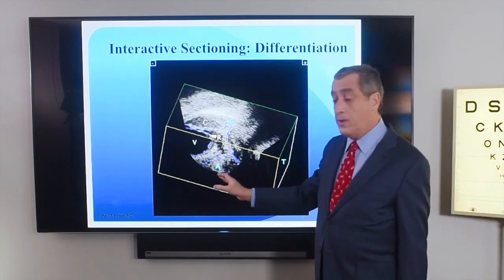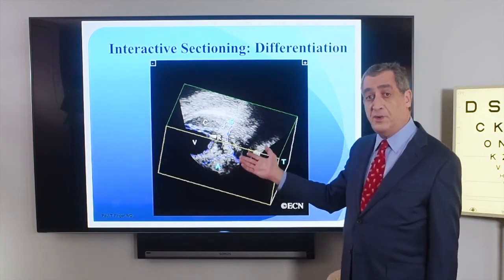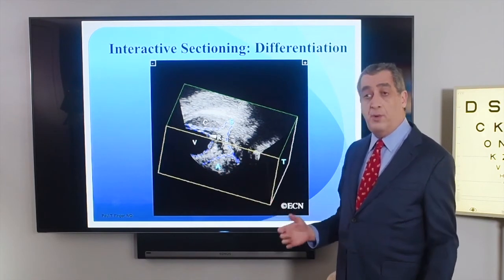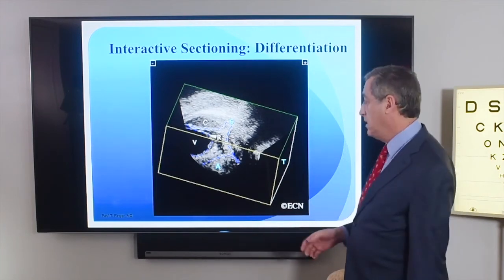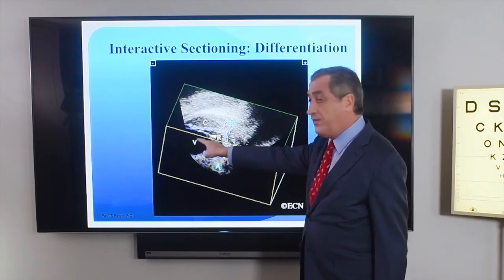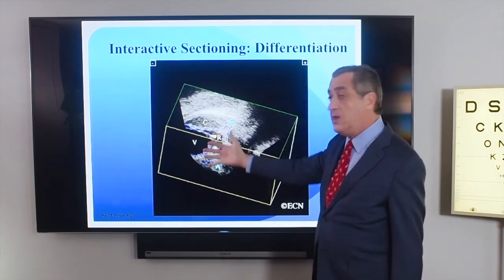This was an example of a 3D image. I used to find that 3D ultrasound was particularly valuable for what I call the disorganized eye, post-traumatic eye, or an eye that had a hemorrhage and retinal detachment all at once. Here we have the retina with the vitreous, that clear vitreous in, but also you can see a choroidal hemorrhage here, here, and here beneath the retina.